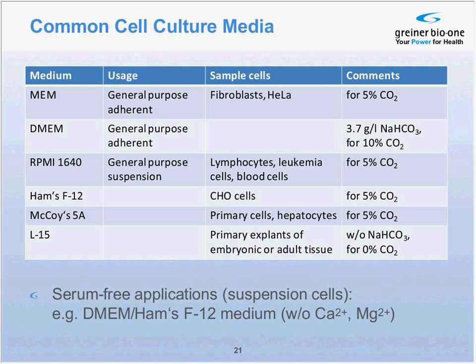For many applications, a mixture of DMEM and HAM's F12 has proved to be beneficial for the cells. The same combination in a formulation without calcium and magnesium works well for suspension cells. Nutrient consumption can be assessed from the media by measuring the pH, the glucose decline, or the appearance of cell debris. Cell debris indicates that actually the medium is not in a very good shape anymore.